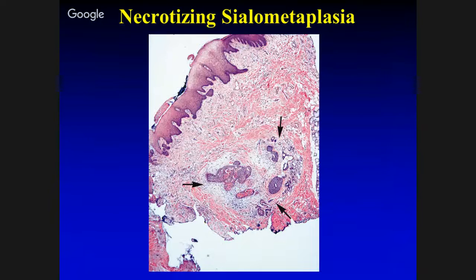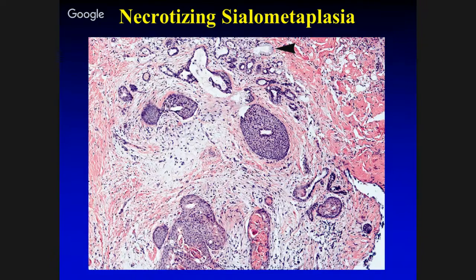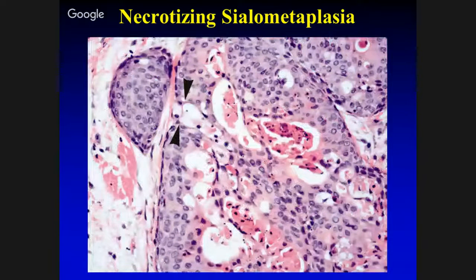Here's another example. You can see the surface on top left is intact. In the submucosa, you can see the lobular configuration. If you look at these, the arrowhead is pointing to residual mucus cells, but some of this looks pretty ugly, including dyskeratosis and karyorrhexis. But if you look around it, two arrowheads are pointing to mucocytes. You can do a mucin stain or DPAS. I prefer the DPAS, at least in our labs. It's more intense red staining, whereas mucin can be very weak and problematic. So if I'm going to choose one of the two, I'm going to do a DPAS.